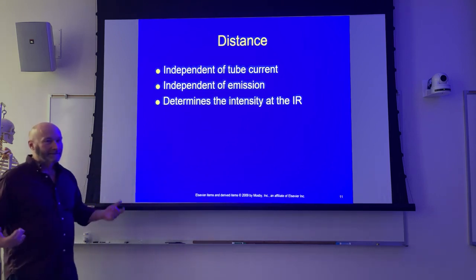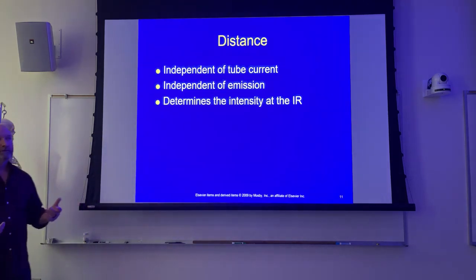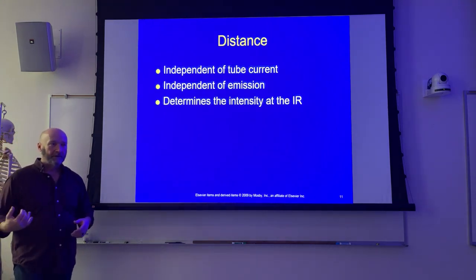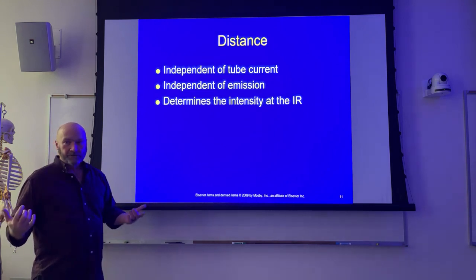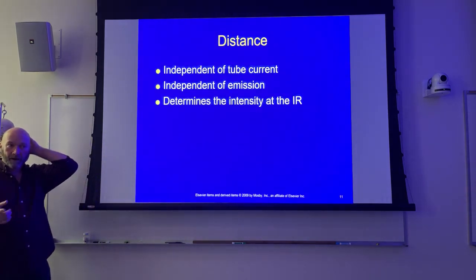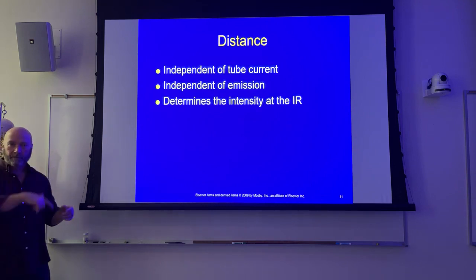So distance is going to be independent of your tube current. So just increasing your distance all by itself is not going to change your tube current. Your technique is still the same. But what do you usually do when you're in the department?